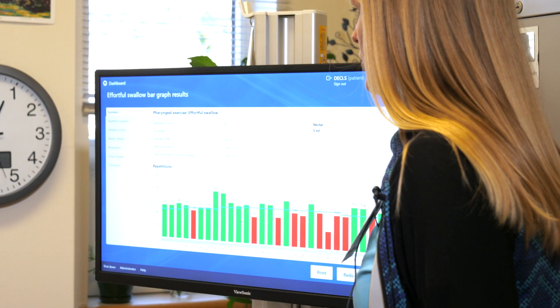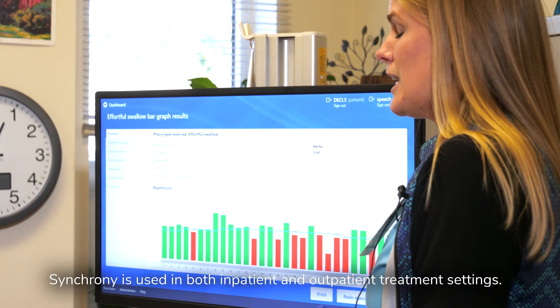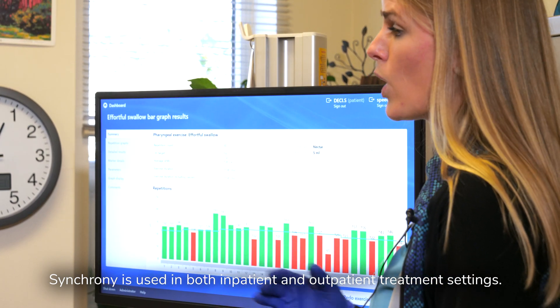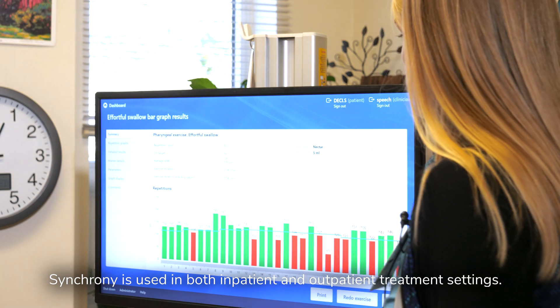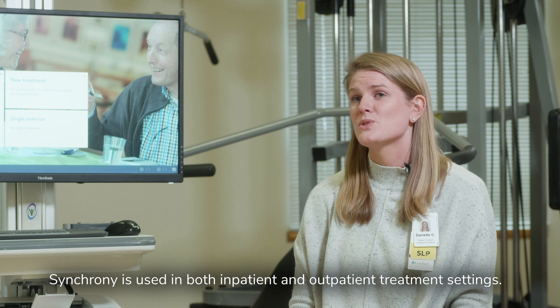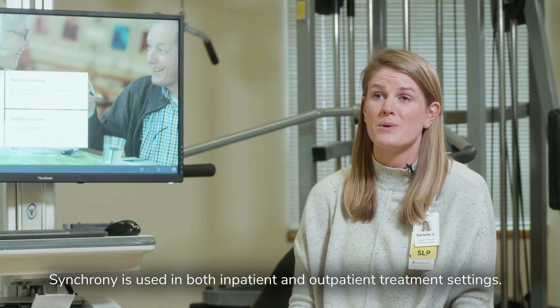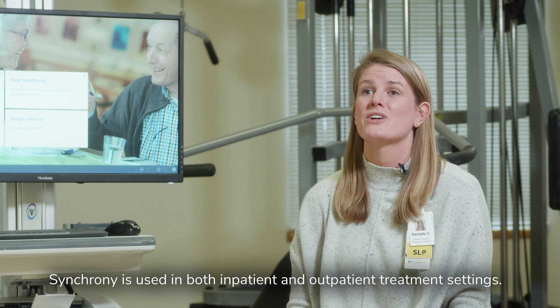Between sessions we can pull up a graph of progress over the course of a week or two weeks, so we can see where the patient was two weeks ago versus today. Using muscle memory, they can then complete those exercises at home in a similar way, which can also help improve outcomes because they're getting more therapy and continuing those exercises.